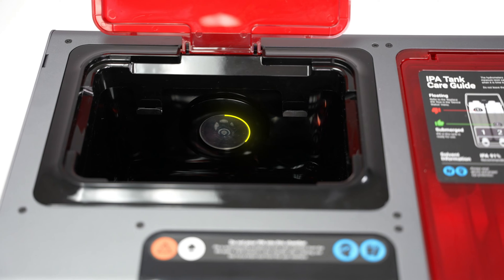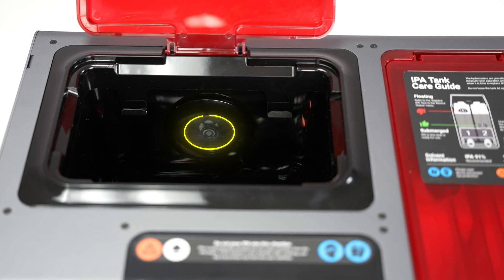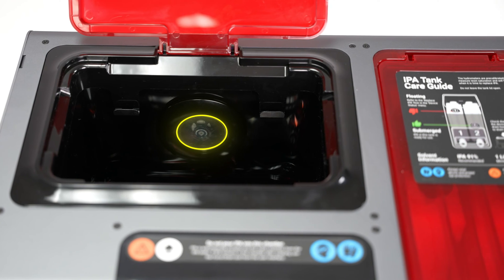The umbrella valve enables airflow during drying and prevents leaks during washing. Do not remove it to avoid damaging your ProWash S.